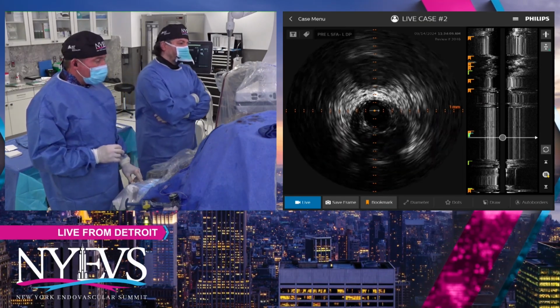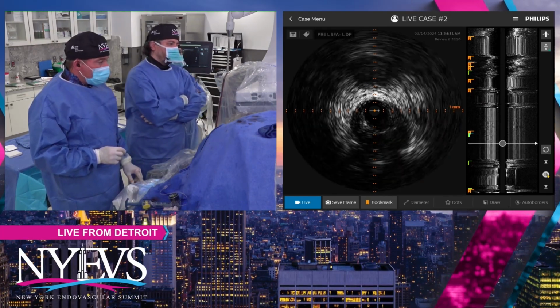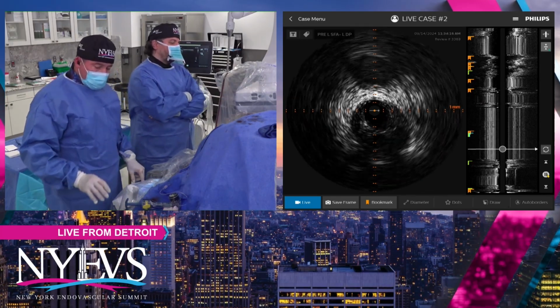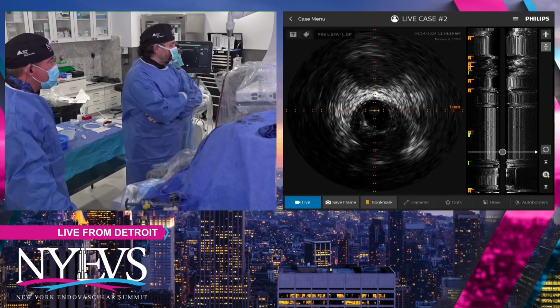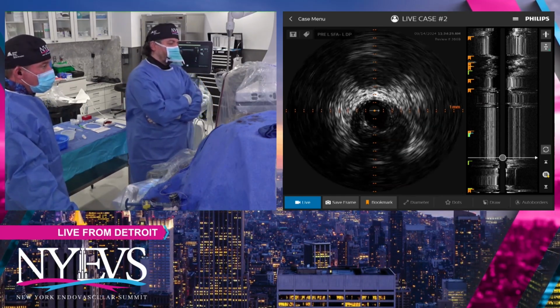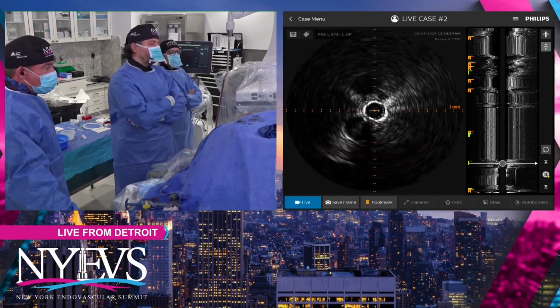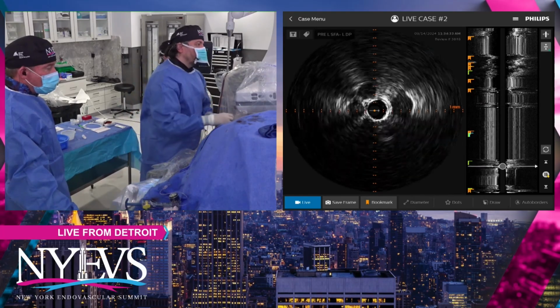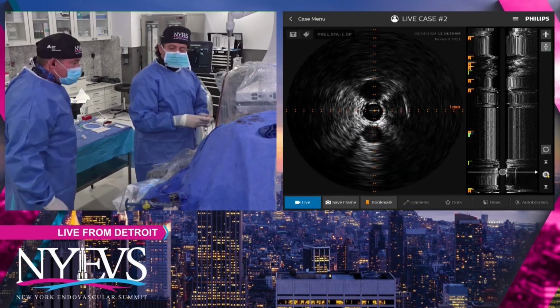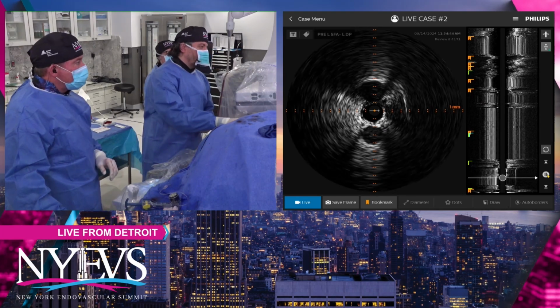I use orbital atherectomy because the nature of the atheroma here appeared to be mixed, especially with tibial, SFA, popliteal disease. This typical CLI patient has multi-vessel, multi-level disease. We want to establish inline blood flow all the way to the foot and possibly try to recreate the pedal loop, or definitely assess the pedal loop in a better way toward the end. I usually size my atherectomy device to the tibial vessel. You can choose to open 2 devices, but knowing the mechanism of action with orbital atherectomy, you can achieve what you need based on velocity, and the repeat numbers depend on your patient.